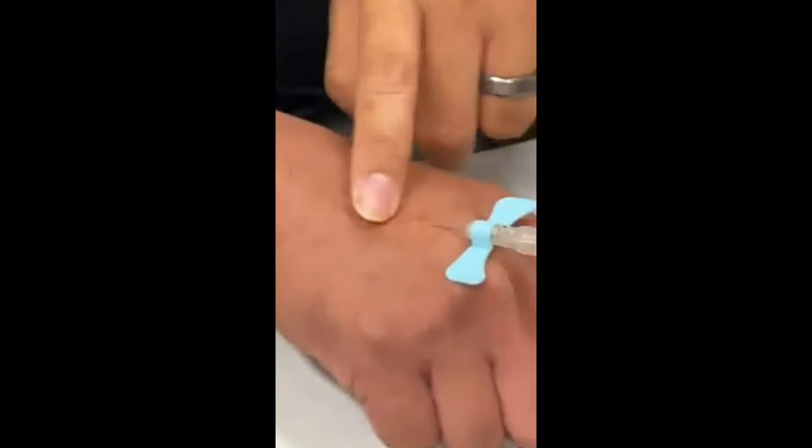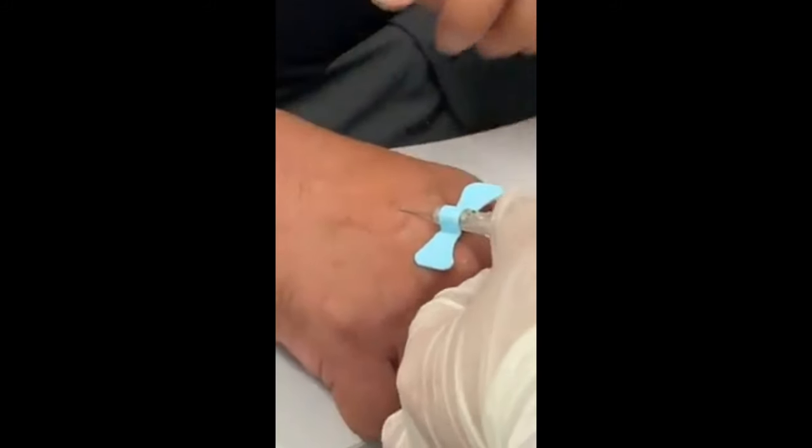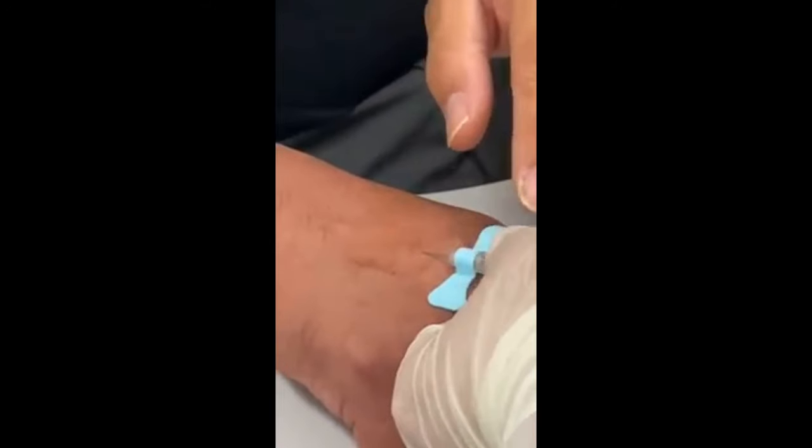Yeah, okay, that's fine. So we'll just start out. Let's say there's blood already, okay? So let's say there's blood. Okay, so we'll do the process. So you see a flash there. Okay? So there's a flash already. So what do you do? How do you secure the needle?